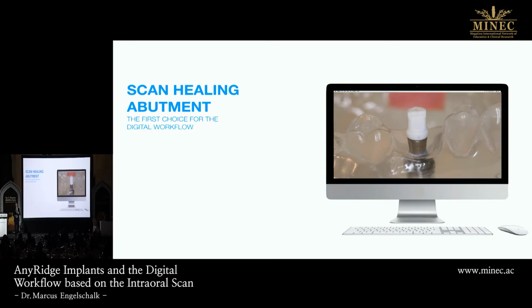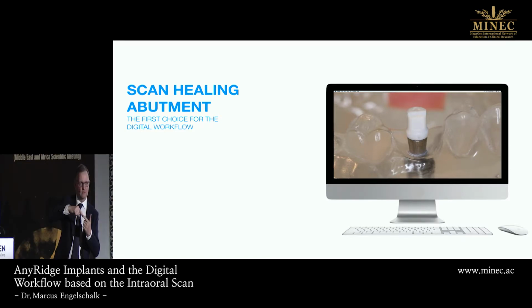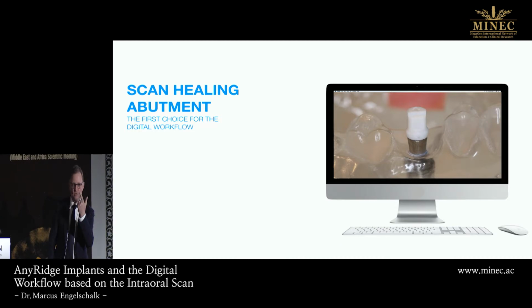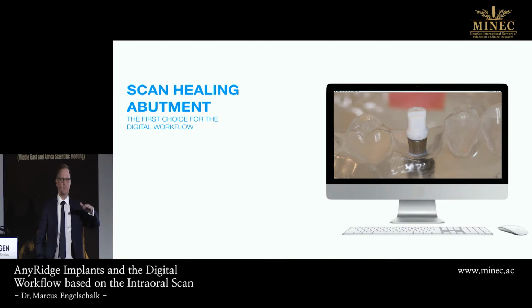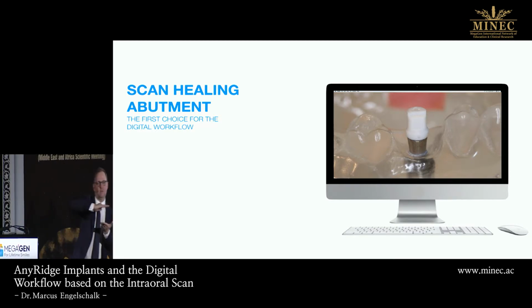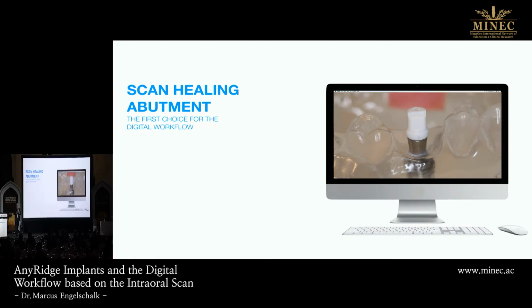You bring in your implant, you bring in the gingival healing cap. Okay. You don't have to screw it if you bring your cap on it just for scanning. You have to unscrew it the first time when you will bring in the definitive abutment or crown. So just 2 times of screwing. And we saw in the literature that 2 times of screwing is nearly the same like you're using a one-piece implant. Means abutment and implant are the same.